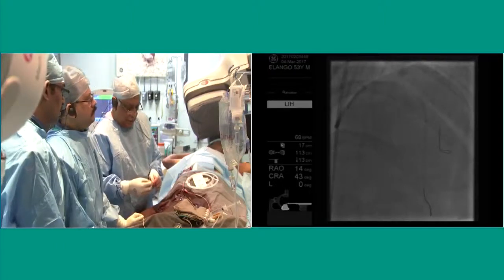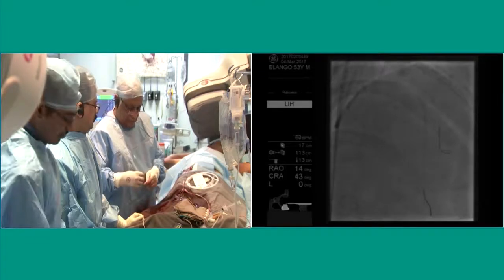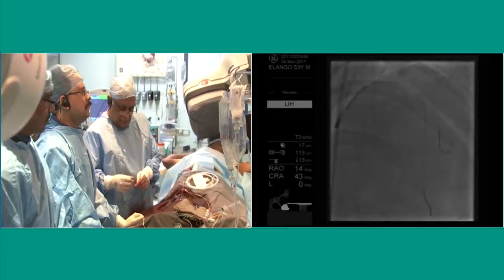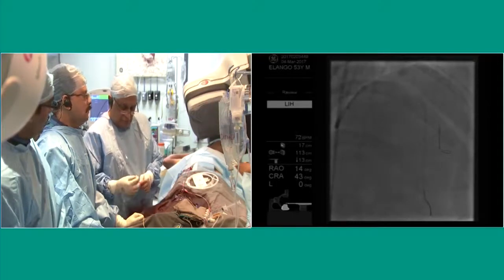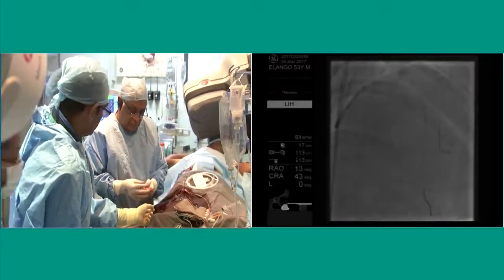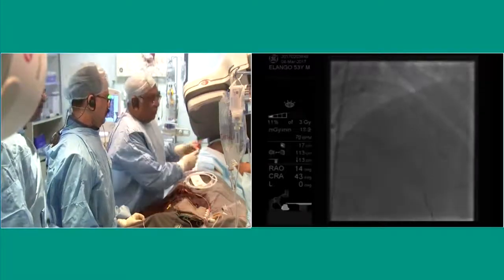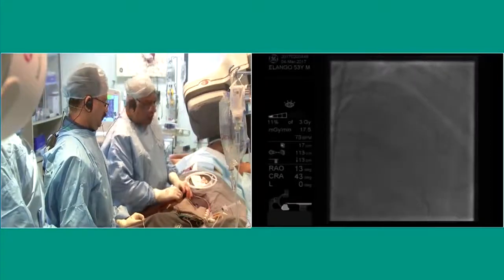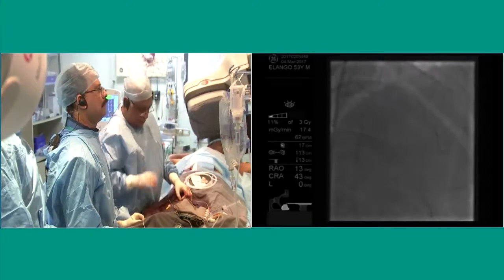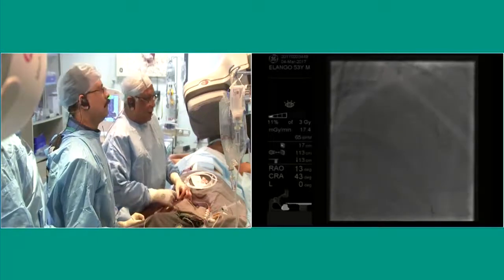BMW. So we have 10 minutes left. The other suggestion is to bring that balloon back into the guide catheter and then advance. I think the shaft of the balloon is probably making wire bias more difficult. Which is correct. Whichever, we will try everything. First, I will listen to your first advice. Bring the balloon back into the guide and then advance the stent. Okay, done. Now I will advance the stent again.